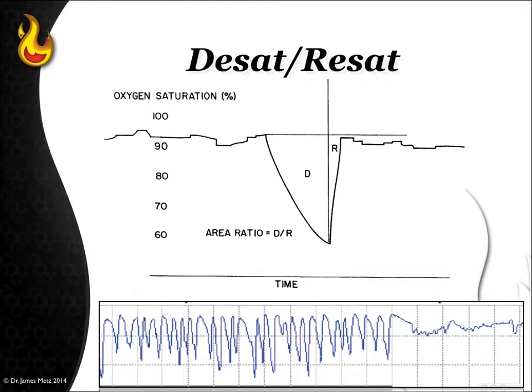Below in the blue is the classic signal for the sleep apneic event. It's called the sawtooth pattern. It goes down, down, up, down, down, up, down, down, up. That's classic obstructive sleep apnea. Well, what about that slope, the down, down part?